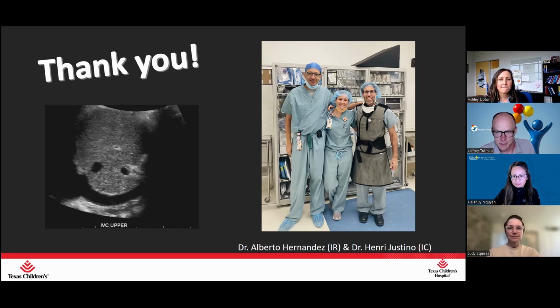And then one of the questions already submitted, which I knew was going to be a popular topic, was the elastography cutoffs for both liver and spleen. I know you had mentioned a couple of papers about spleen elastography and what the suggested cutoff value was. There's been a lot of work on liver elastography and defining what our cutoffs are. And like you mentioned, there's gender or vendor specificity with those values. And then what our abnormal value cutoff should be.